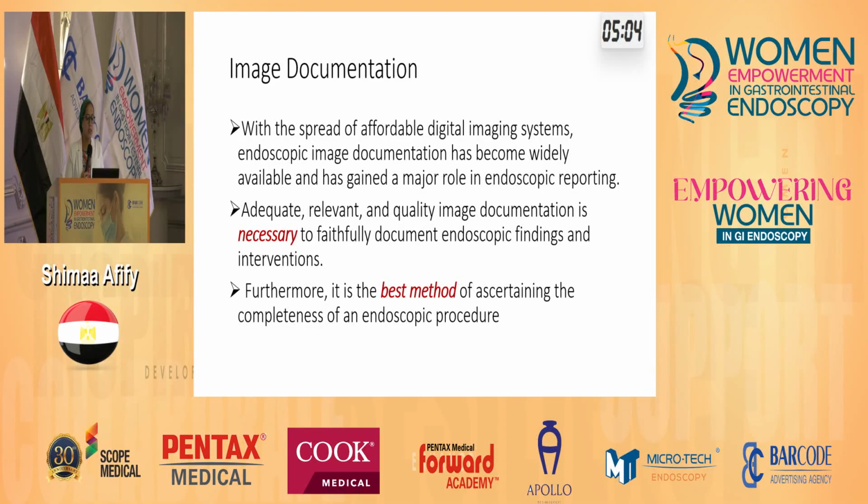Adequate and relevant quality image documentation is necessary, and it faithfully documents the endoscopic findings. It is the best method to ascertain that you have completed the examination and also that you diagnosed the lesion that is present. You don't have to describe it in your report, but just a picture would document and describe everything you want to say.